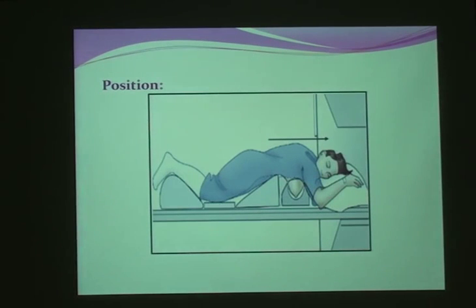The position is very important. We should inform the lady undergoing this investigation that it's going to take a specific time. She's going to lie prone with her breast hanging in these coils. We should offer her a pillow to comfort her arms and head, and we should put the cannula.